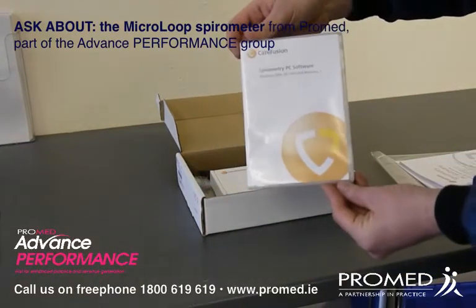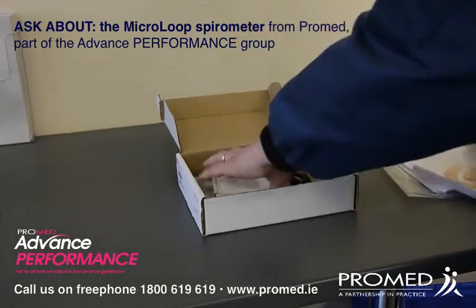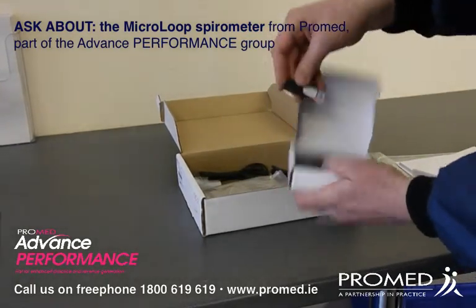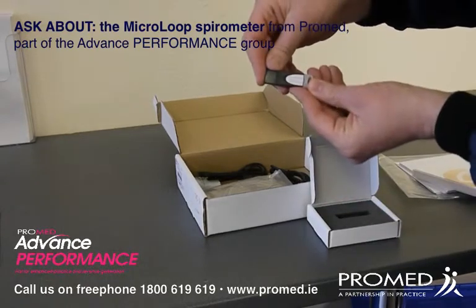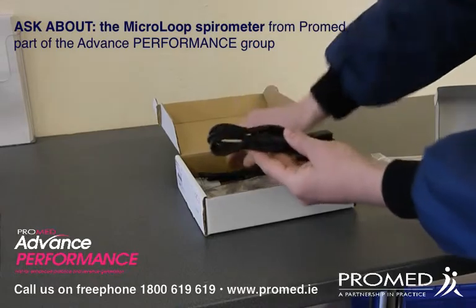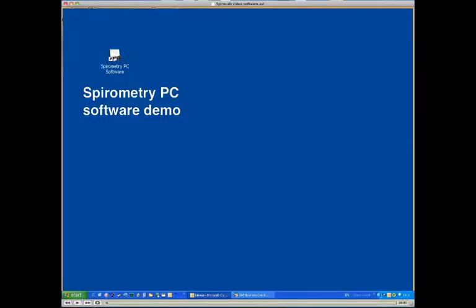You'll see the software itself, and you'll see the USB dongle which gives activation to the software. And of course the cables that connect up the device do come with this.